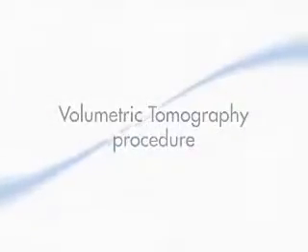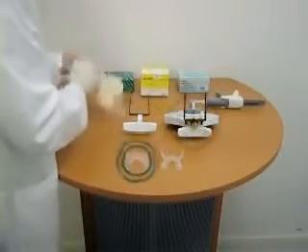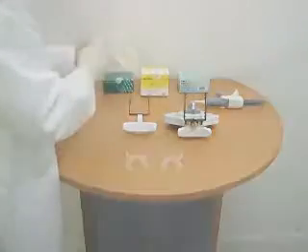Preparing the bite index. Choose the appropriate size bite plate. Make sure that the bite plate is facing upwards before applying the impression material. Insert the plate into the patient's mouth and ensure the bite is centered.